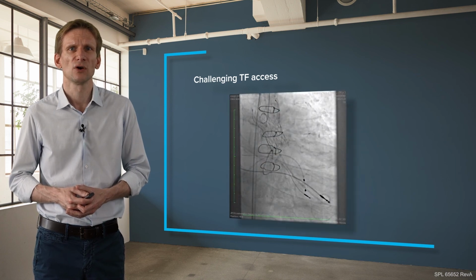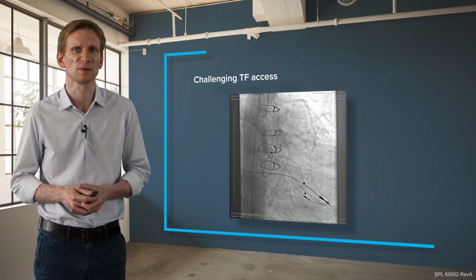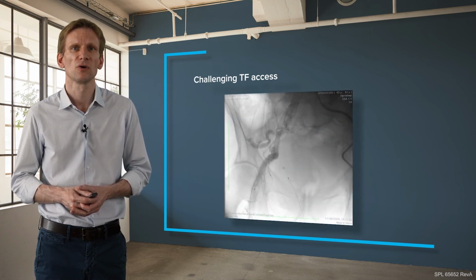And then at the end, we had a very good closure as well. As you can see on the closure device, this was a collagen-based closure of the vessel. But again, nice flow, TIMI 3 flow, no obstruction, no bleeding, no stenosis.